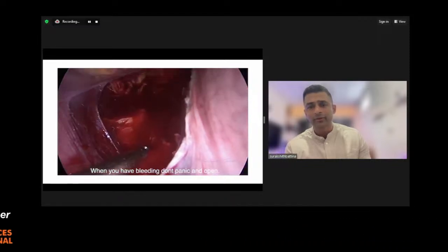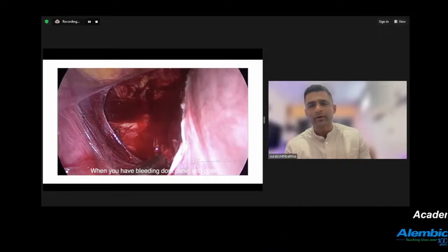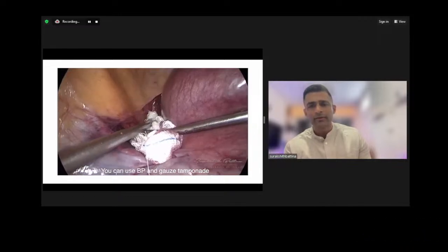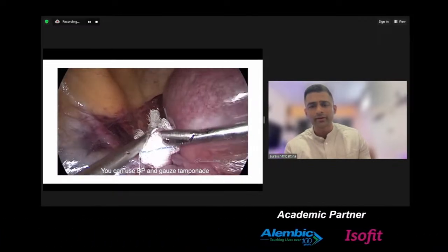Sometimes the bleeding is more severe, like in this case, you can see the bleeding is much more severe. At which point you can go ahead and bipolarize it as well. But unfortunately, in this case, it did not stop. So we go ahead and we also use a tamponade with a gauze piece, and then we also used an Interceed.